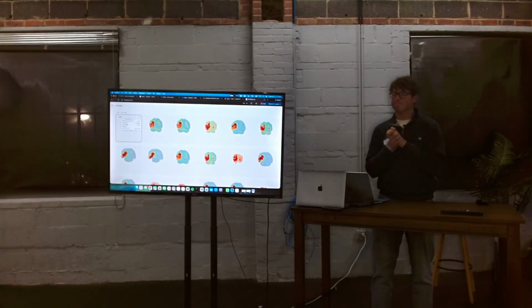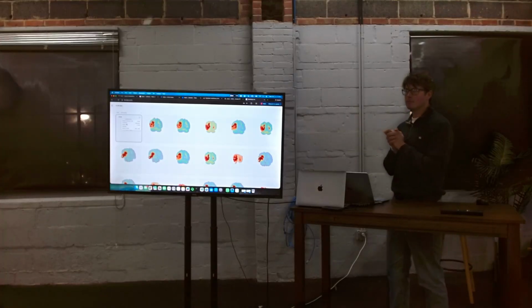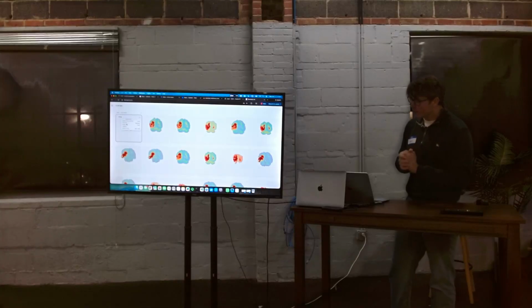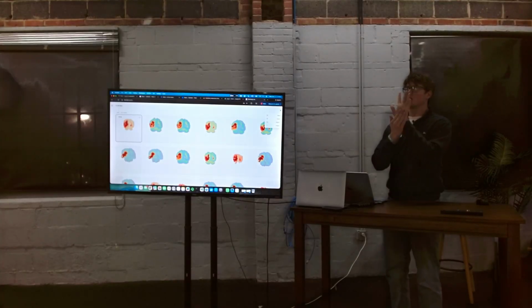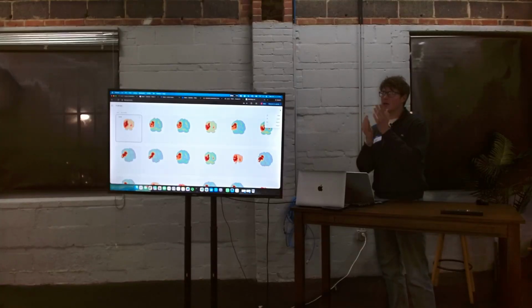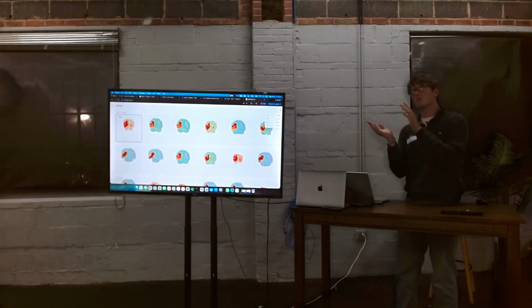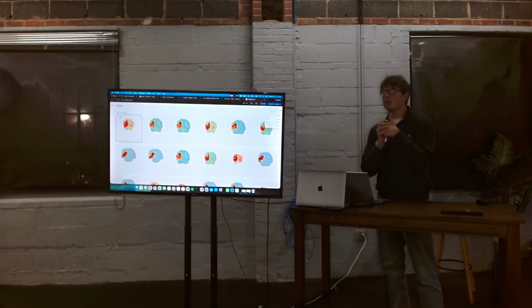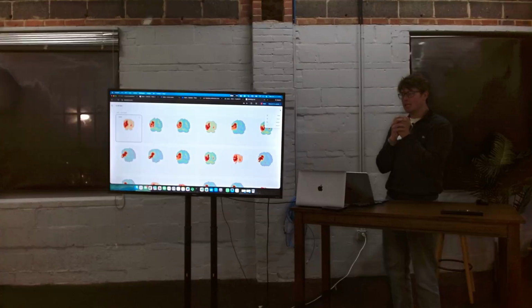So the output from this process is another file basically of the same format? If I were to export it, I would export all of the images that were extracted. A popular format and a popular data set is called COCO. So I would probably export all of the images and any other important information, so that it can be easily fed in through something like Roboflow to actually fine-tune a SAM3 model. And then you would hook it back in.